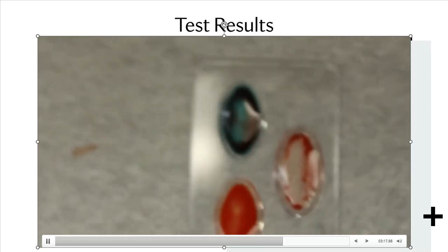Also, when you are done with this particular lab experiment, please do not throw your samples away in a regular trash. As the last part of that video, and I'm going to save you a couple of minutes here, I'm just going to stop it. The last part of that video is going to show you a biohazard trash can. It is a very small trash can that we will keep near the blood typing area. Whenever you get done with your toothpicks, the blood typing slides, anything that's come in contact with your blood, that needs to go into the biohazard trash bag. Do not put that into the regular trash can at all.